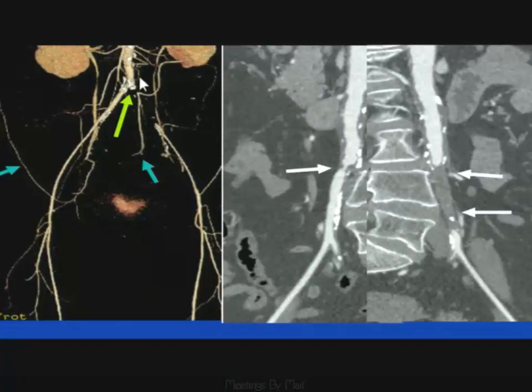Here's another case where we have aortoiliac disease, and clearly on this side, occlusion of the common iliac. And notice, you don't really see it on this VR display, but when you use the curve plane, you pick up this pretty tight stenosis at the origin of that proximal common iliac artery. So we are going to give you a topographical display with volume rendered in color, better with MIP, and then we're really looking at focal stenoses with the curved planar reformation that we use to go down the aortoiliac, go down the femoropopliteal, rotate it, get the correct projection, and really demonstrate the tight stenosis.